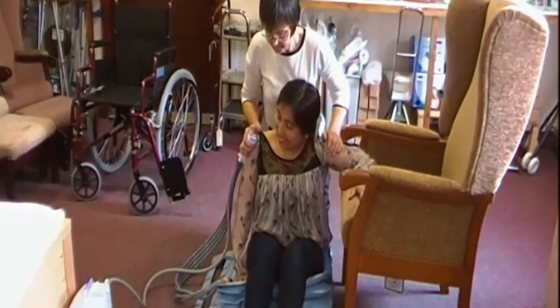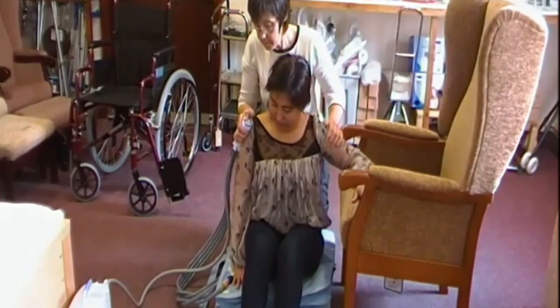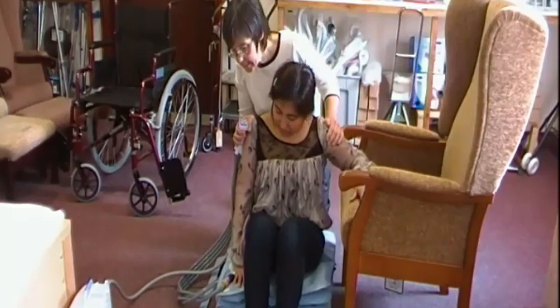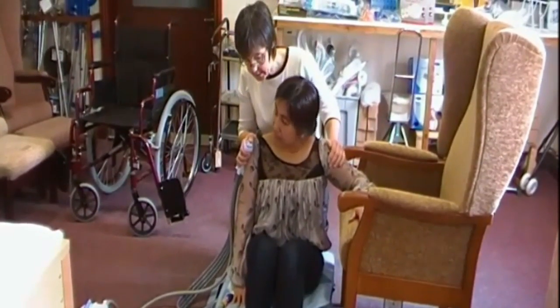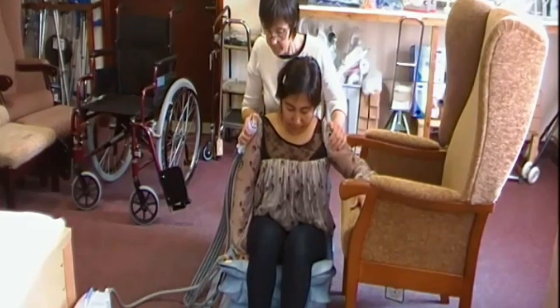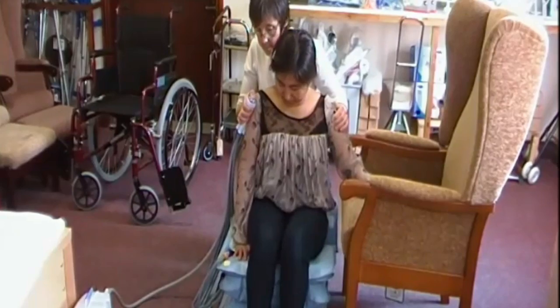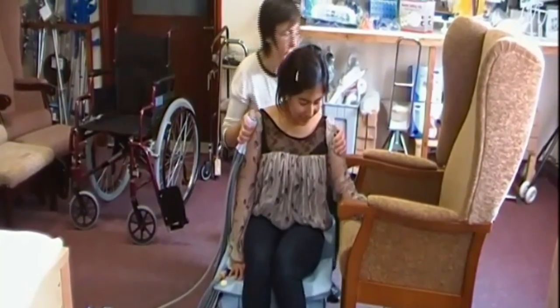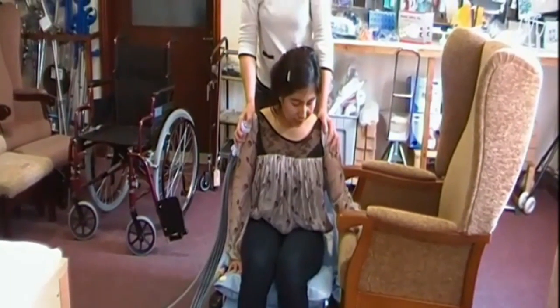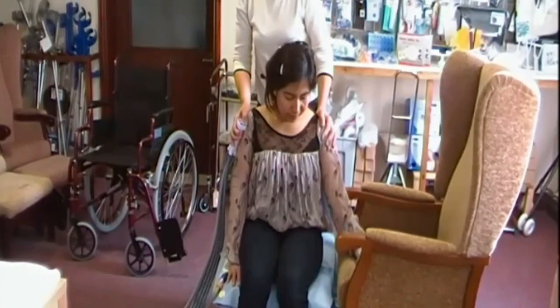Feel alright? Yeah. This is when the person's wobbly, this is when you have to support them. But once you get up to, it's absolutely solid, isn't it? Yeah. Okay, you're okay? Yeah. So at this point you check the person is sitting fairly centrally and feel confident to go to the next stage. And we'll go to the second position. Then you stand up, and when you get to the third cushion, that will be high enough for Grace, and she'll be able to then stand up and move to her chair.